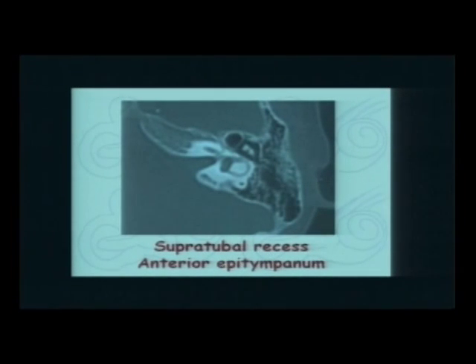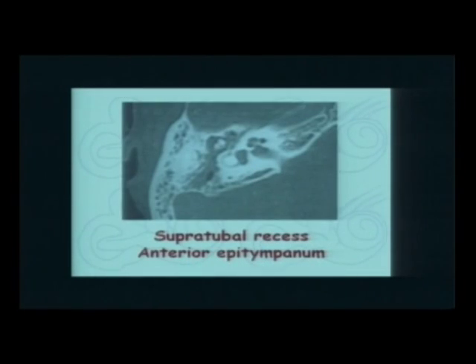And then the supratubal recess, because you are too tired to reach that area after your surgery. So please, this is the most important of all of them. Never forget a cholesteatoma right there. This is another patient in which there is actually a cholesteatoma. You drilled all that out. You've removed the cholesteatoma, and you see this ridge of bone hiding behind it, a supratubal recess.